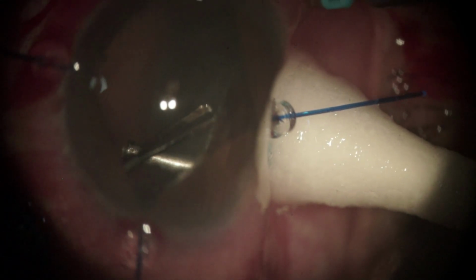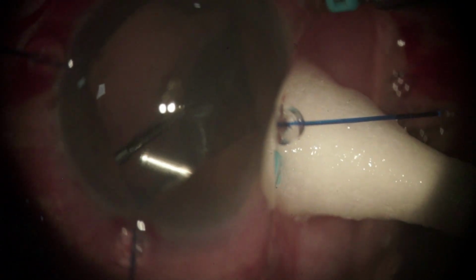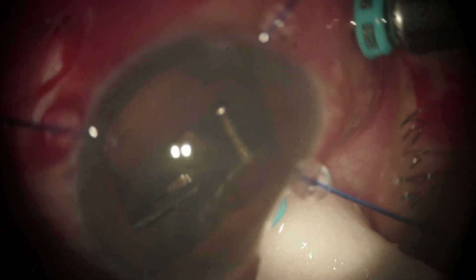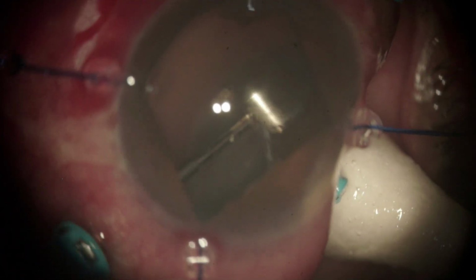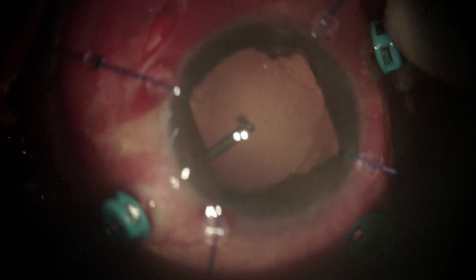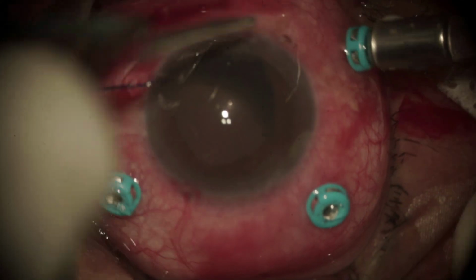This procedure is repeated at all clock hours. Once completed, the iris hooks are removed.